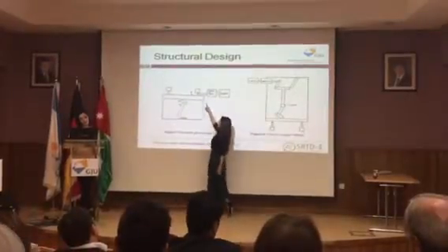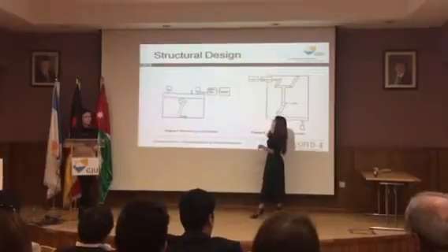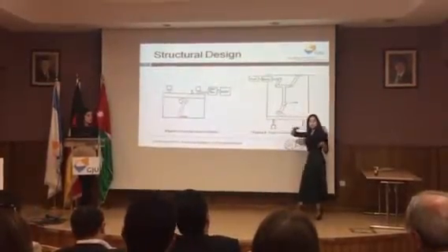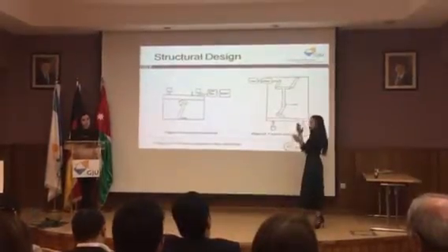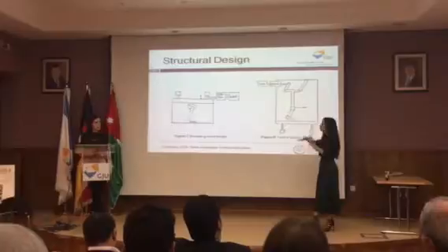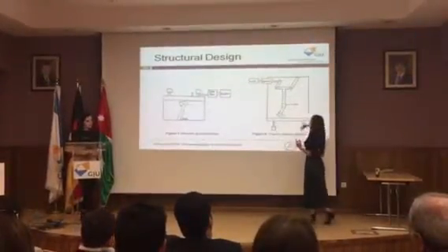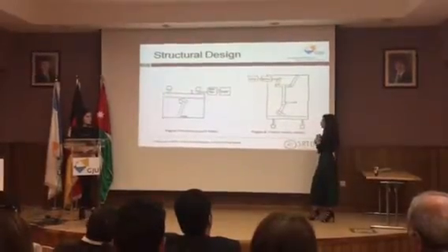So this is considered the platform or the ground, and it has pistons that are driven by a motor and a gearbox. What that does is allow vertical movement up and down, which basically mimics the gait. So as the foot moves, the foot doesn't need to be movable because the ground is basically subjecting the movement onto the foot itself. In contrast to here, where we can see we have a lot more components.